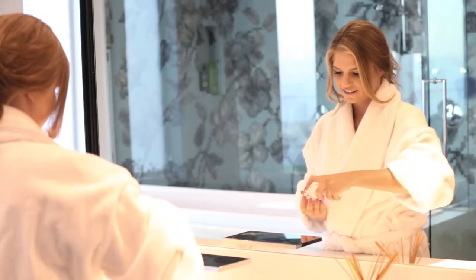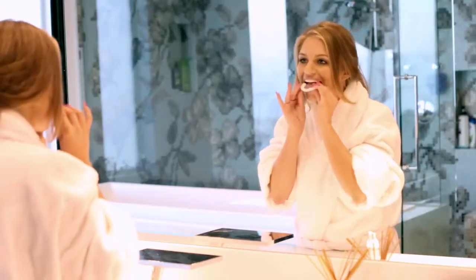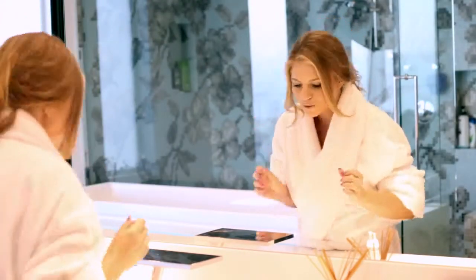Using Eversmile White Foam is simple. Just place a pump of the foam into each aligner, pop the trays into your mouth, and spit out any excess.